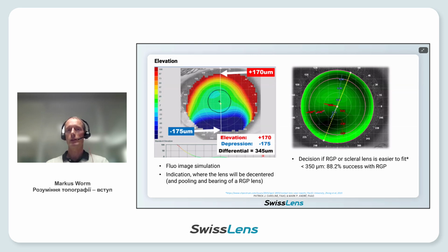So a difference of 345 micron. And the rule says that if you have under 350 micron, an RGP lens would have a success of 88% in the fitting, and that has been taken as a limit or as a threshold.